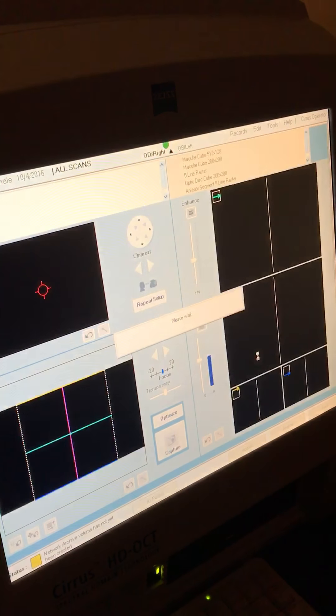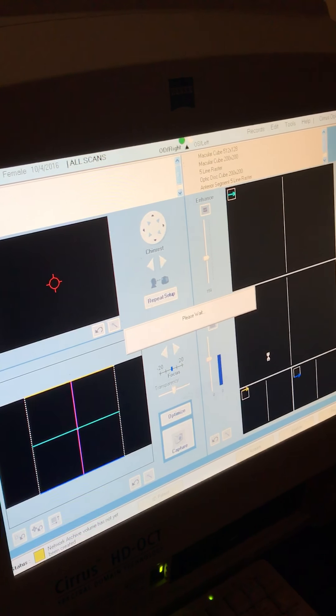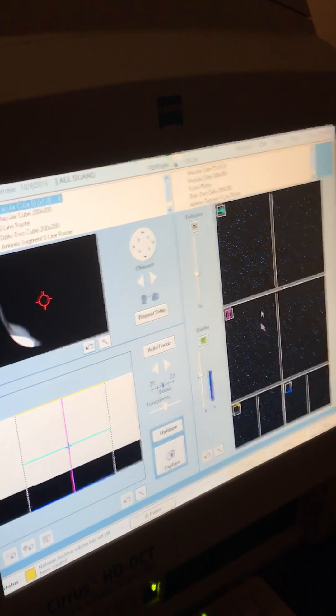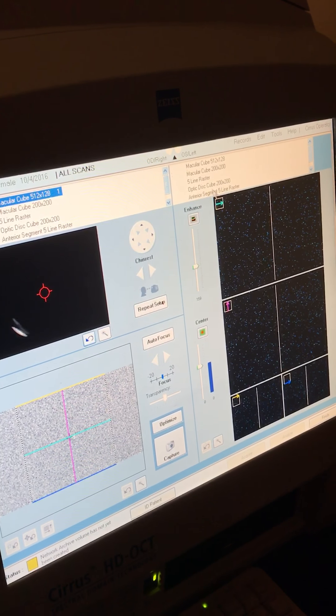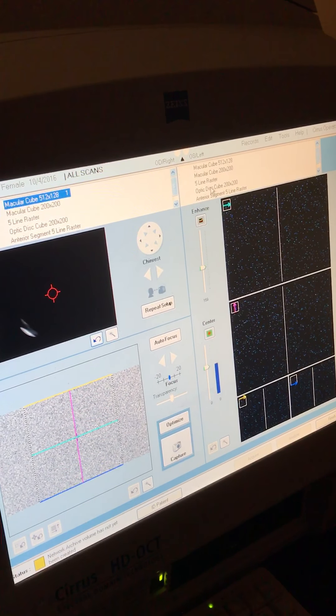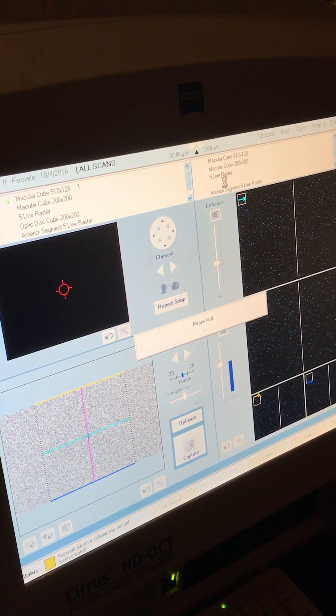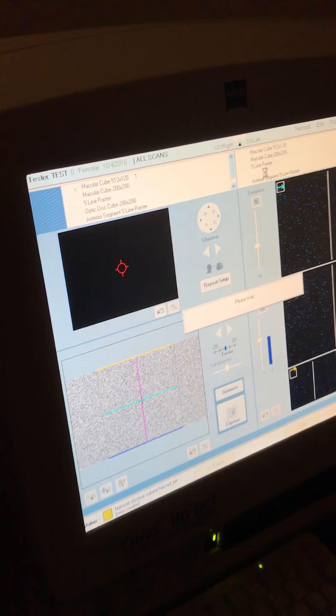And then we'll do the OCTG for her left eye. So we're going to click the optic disc cube 200 by 200 for left and now come to the right side here.